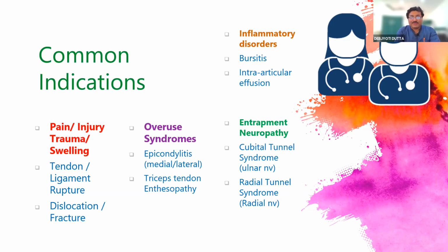Definitely, the bony abnormalities are better evaluated with the help of X-rays or CT scan. But for the smaller bones, the bony irregularities can also be observed with the ultrasound, along with the changes in the tissues.